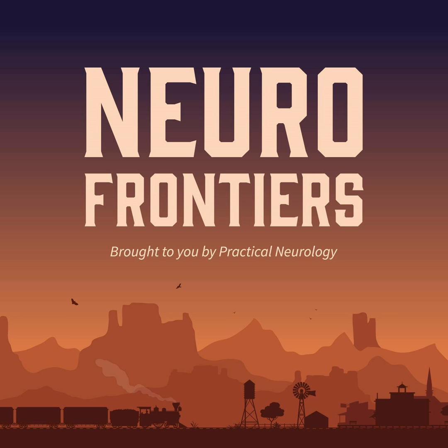Excellent. As a starting point, when should neurologists order intracranial vessel wall MRI? I think there are two main clinical indications. First is when you already know the patient has some sort of vasculopathy. Typically at my institution, patients will come in and already get a CTA of the head or imaging workup of some sort of neurologic deficit. And then from there, you can already visualize that there's an abnormality with the vessels because you see stenosis, for instance. In which case, the next question is what's causing the stenosis?